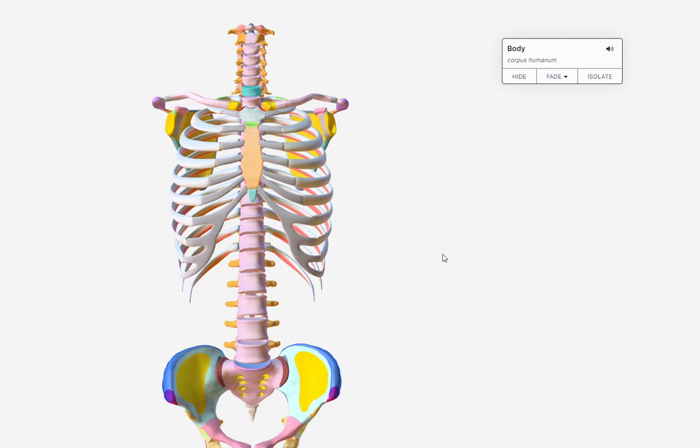We call it an anterior posterior projection, AP projection. All right, but their back is against the bucky. So now I'm going to rotate them into obliques. So now, look, we're facing our patient and talking to them. It's like you're standing and talking to a person, right? So if this patient raises their hand that's not there on this side, this is their left side, the patient's left side.